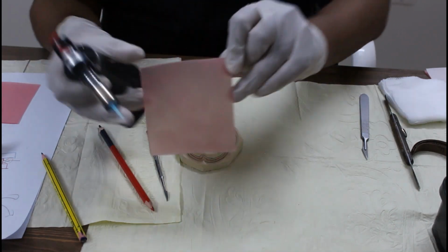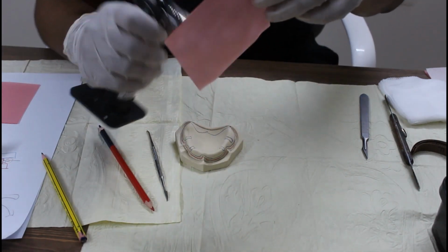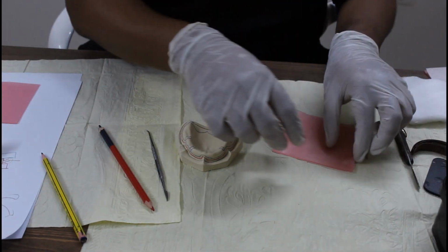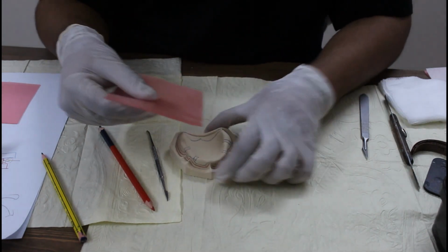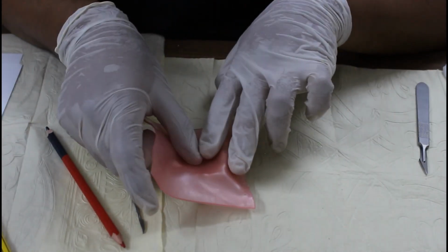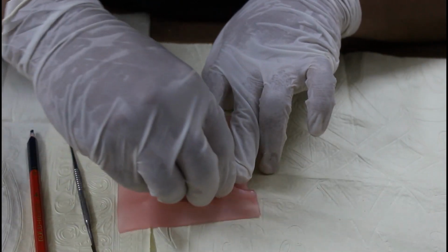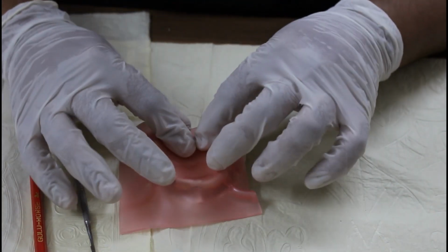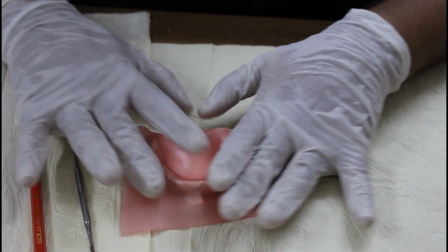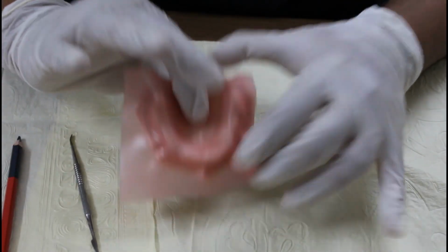So keep on changing the position, keep on rotating the wax sheet. Okay, just make it soft. Switch it off carefully. Now the wax is soft. So place the wax sheet on one side, slowly press it on the cast and adapt it. Okay, do not apply lot of pressure in the center area, otherwise the spacer will become thin. So now you will see that we have adapted it. You can see here.